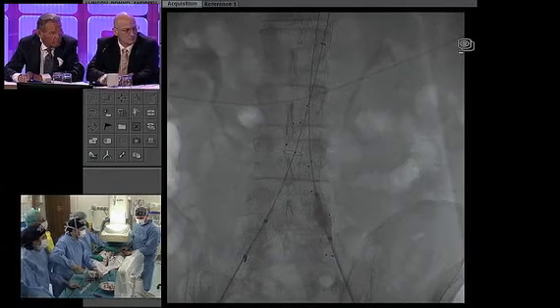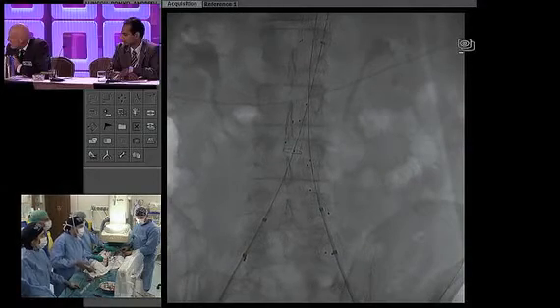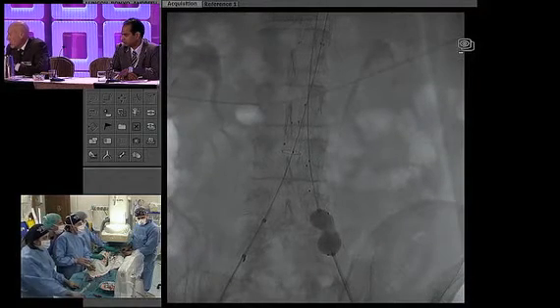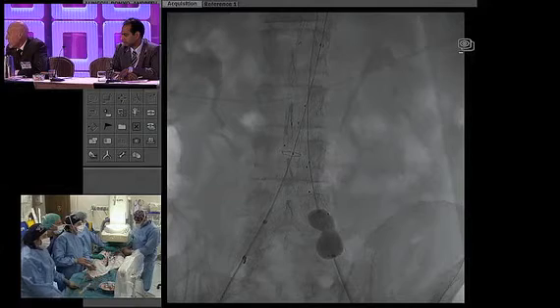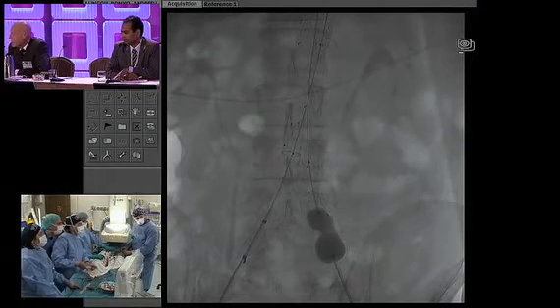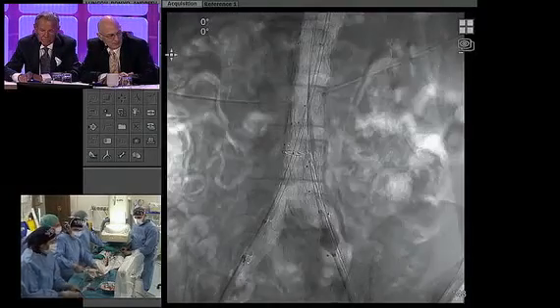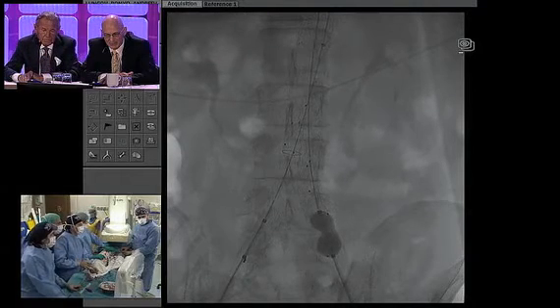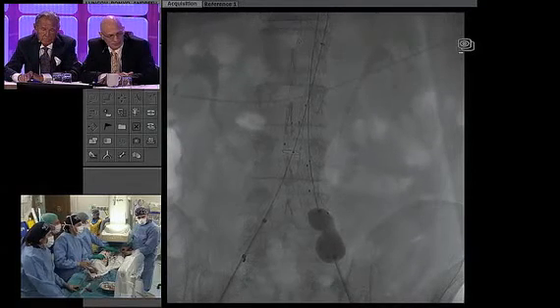Daniel, the fact that he has an approach from the top, from the humeral, he can also, at the same time, prolong to the hypogastric and another graft to the external artery coming from below. But it's another option. He could do that, except he's from a radial artery, which would make it very challenging because of the diameters. But that's another method of dealing with this. And if access from above is already obtained, obviously that would make it easier to deal with here.